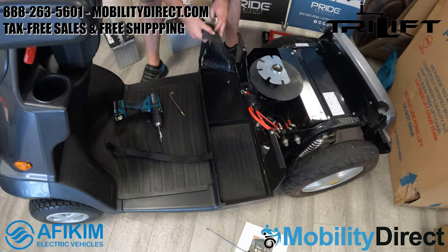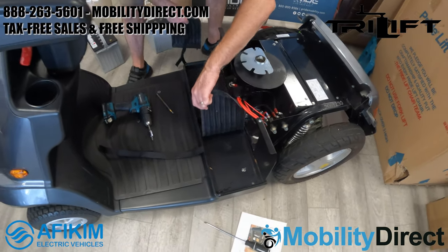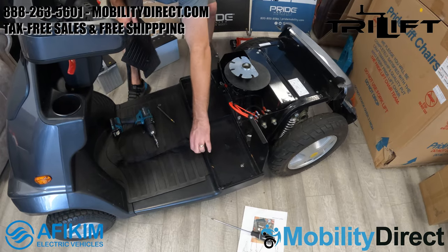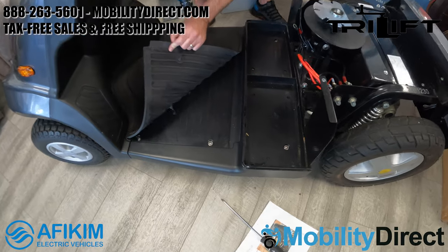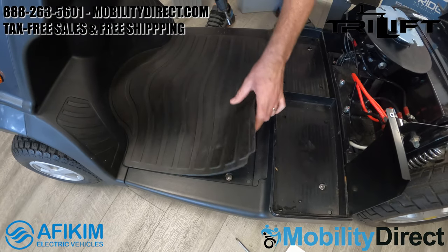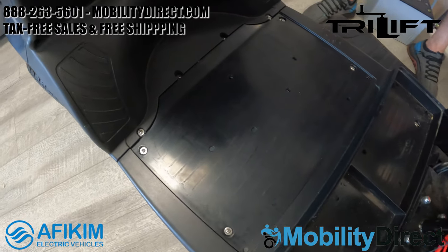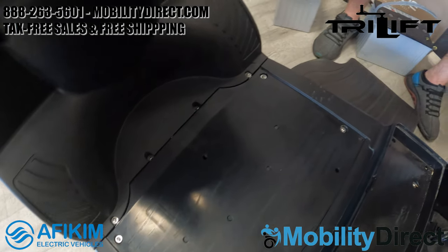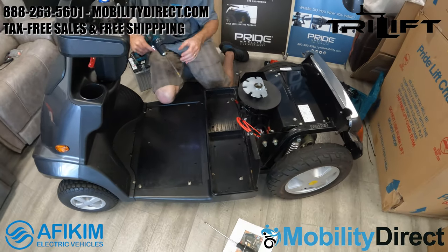Once the batteries are removed, you'll want to go ahead and remove the pads that the batteries rest on to expose two hidden screws. You also want to completely remove the straps and then remove the floorboard padding on the main floorboard area to expose an additional set of screws. We're only going to need to unscrew a total of eight, including the two that are under the battery pad.